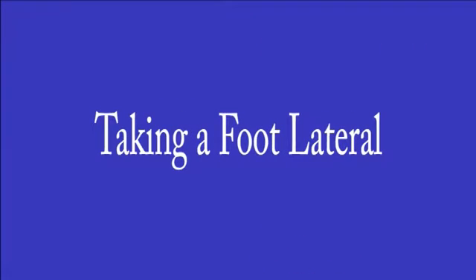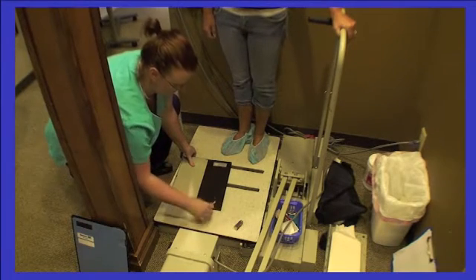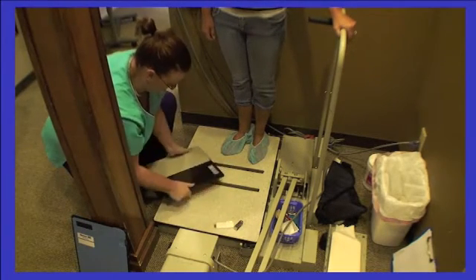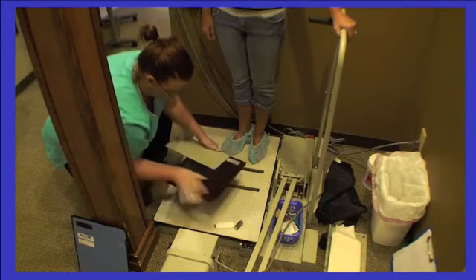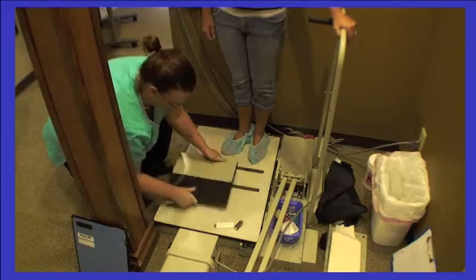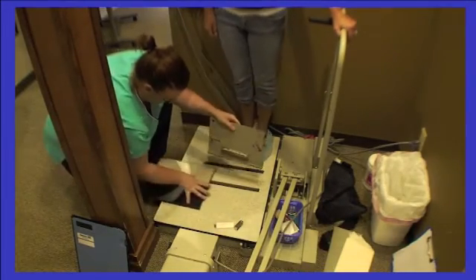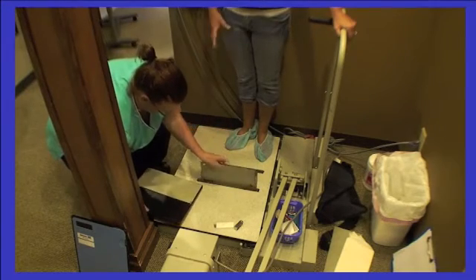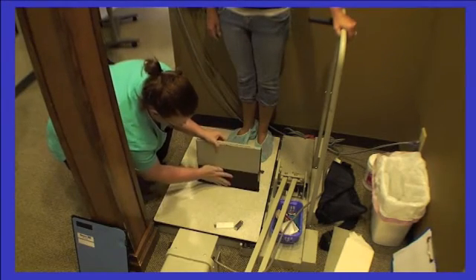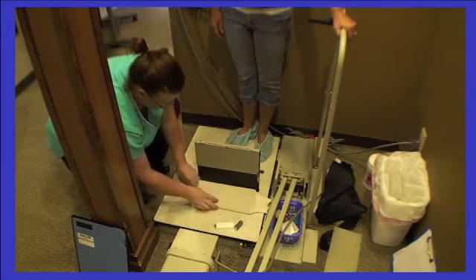Now that you've taken the AP view, you'll take the lateral view of the foot using the same plate that you used. To do so, pull the name label and left-right indicator from the cassette and change the lead plate from the side it's on to the side you just took the AP on to make sure it does not get double exposed. For the lateral, you will want to take a side view of the foot, so you'll need to grab the film holder and place it in the farthest back of the 2 slots in the platform. You will then slide the cassette into place on the holder, with the side you want exposed down towards the platform.